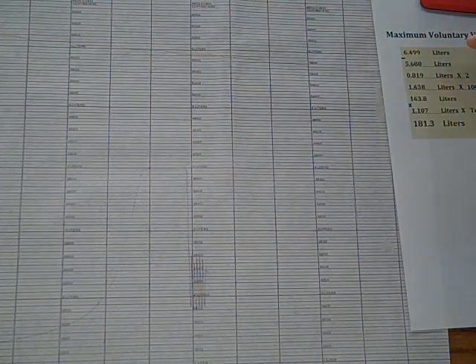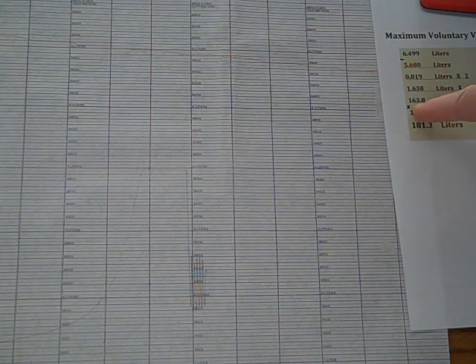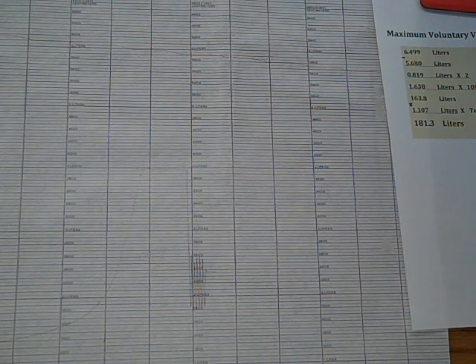Once we get that amount of air, we double for the paper, and then we have to multiply that 15 seconds, which is 1/4 of a minute, times the 1/25 of a breath this measures. Well, 4 times 25 will give us 100. And we'll basically move the decimal point over a couple places, and then we'll correct for the temperature, and we have our liters on maximum voluntary ventilation.